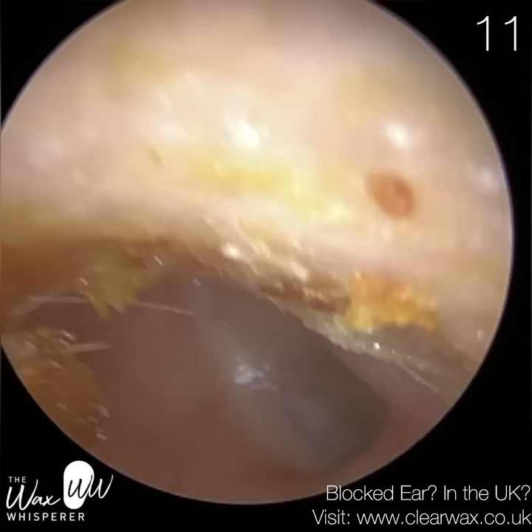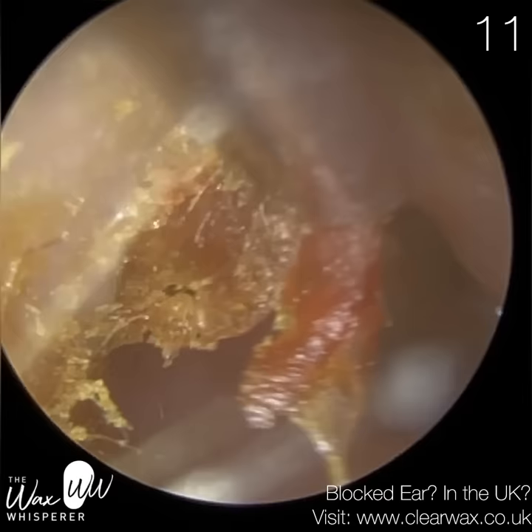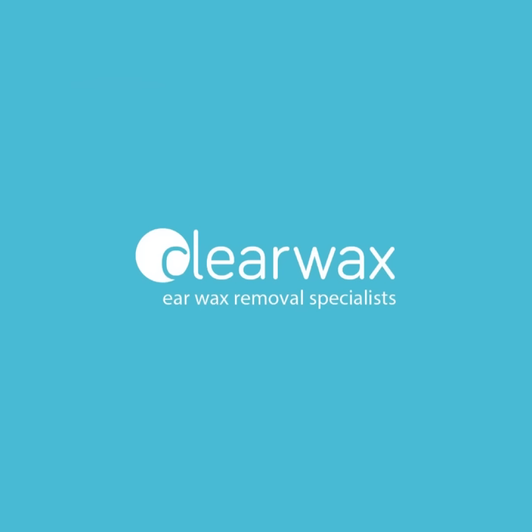That plug came away. Reverting back to suction just to mop up some of this sticky skin lining the roof of the ear canal — that's the front section, the lateral third. Well, I hope you enjoyed that compilation video, guys. Take care, keep well, and speak soon. Bye.